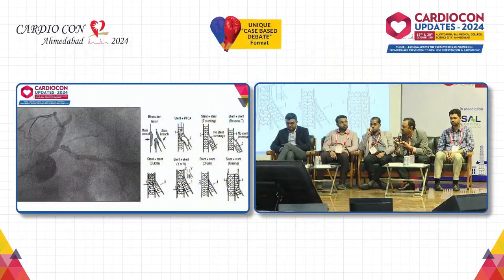Most often, if there is no lesion in the circumflex ostium when you do imaging prior to the crossover stent, if the circumflex is normal, and post stent if FFR is normal, then probably you don't need to touch the circumflex initially.